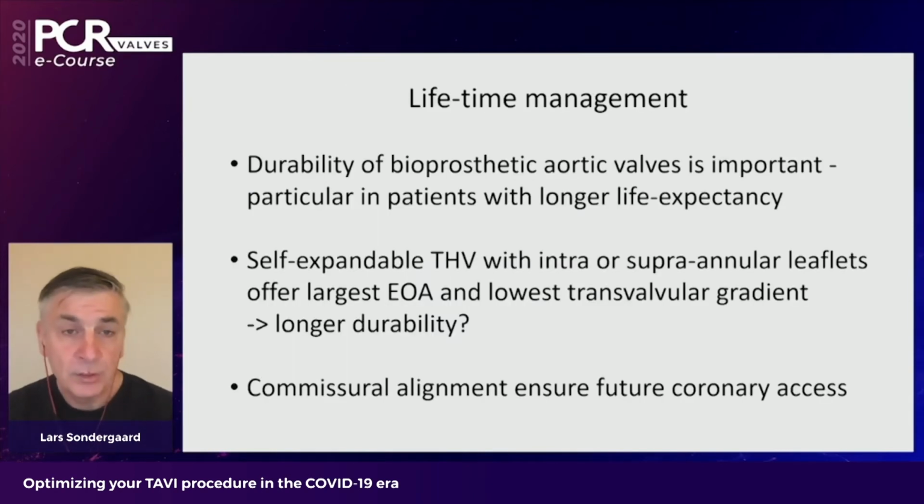So just to conclude, if you want to take lifetime management into consideration, treating these patients with longer life expectancy, you need to understand that the durability of this bioprosthetic aortic valve is really important. Self-expanding transcatheter heart valves seem to offer better durability due to the larger opening area and the lower gradient, and there's no difference whether you choose an intra- or supra-annular position of the leaflets. And commissural alignment is easy with some of these valves, particularly the Portico valve, and that's going to ensure easy future access to the coronary arteries.